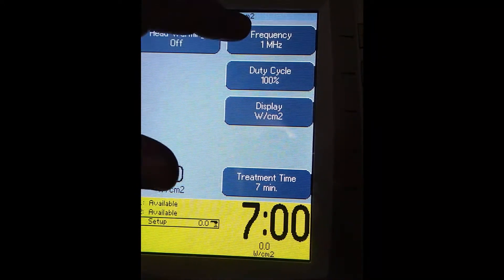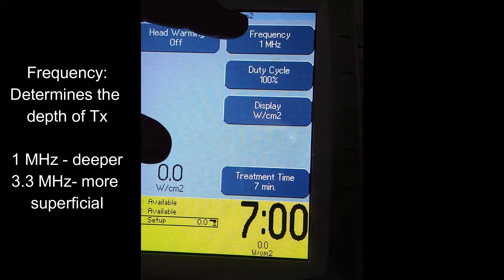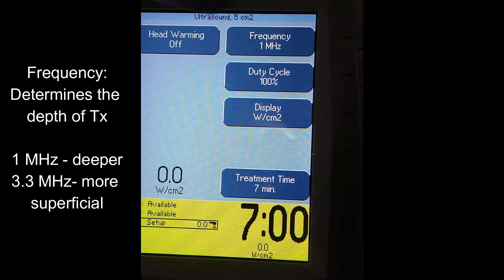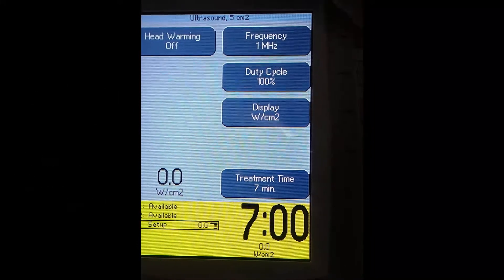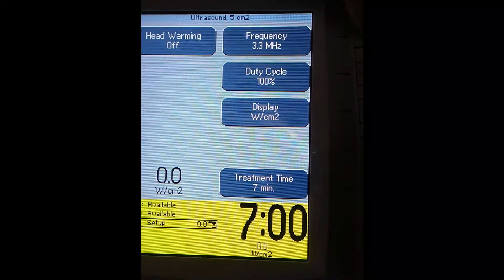The next button is Frequency. Frequency helps us determine how much depth we want to go into the tissue. At 1 MHz, we reach deep tissue. Toggle the button to 3.3 MHz for superficial tissue.